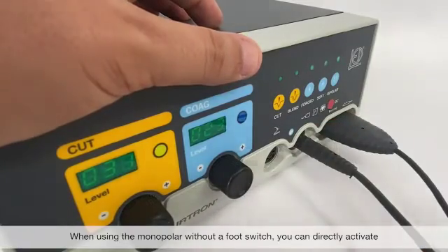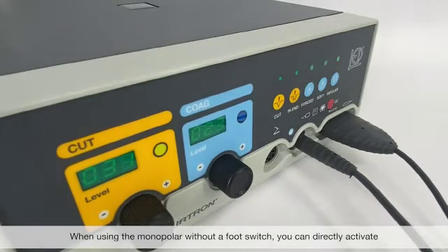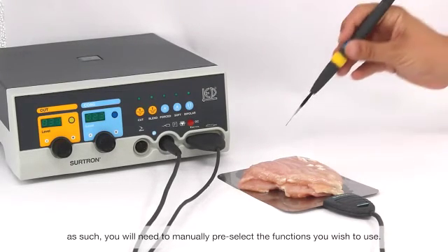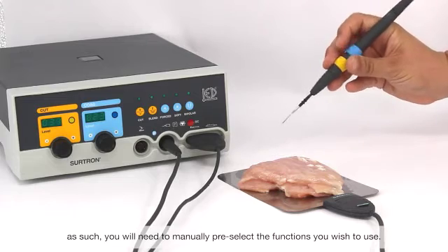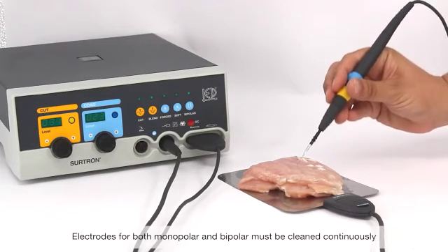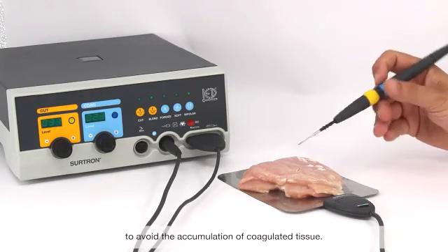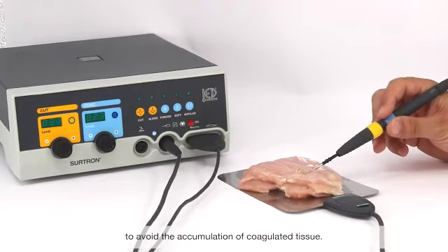When using the monopolar handle without a foot switch, you can directly activate the cut and coag functions by using the buttons instead of pressing the foot switch. As such, you will need to manually pre-select the functions you wish to use. Electrodes for both monopolar and bipolar must be cleaned continuously to avoid the accumulation of coagulated tissue.